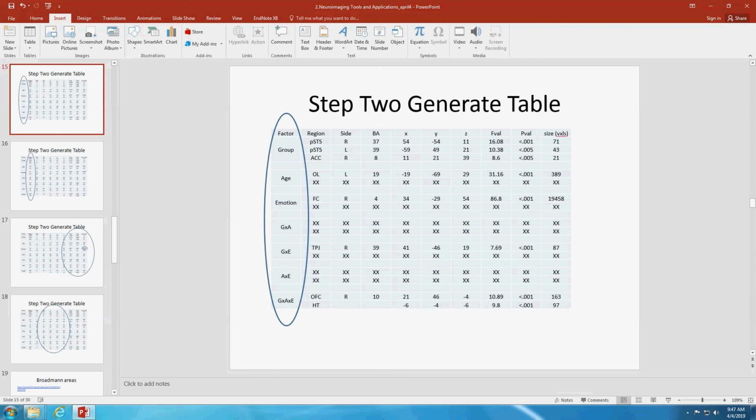Another key aspect with this is where we're labeling things like the Brodmann areas and the regions. Those are from atlases that have coordinate systems, but it doesn't mean that exactly that was the area for each person. It's our best overall guess because it's not a one-to-one thing. So that's why I think a little more human intervention is helpful for deciding where things are. But the coordinate systems are where we found those things. It's just what those coordinates exactly mean. It's kind of an interpretation part.